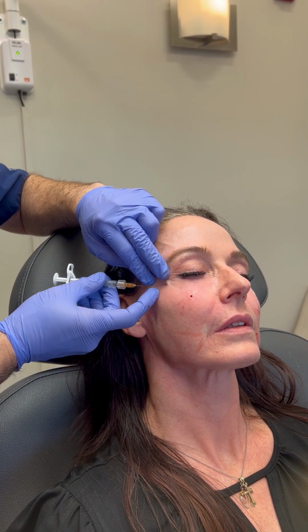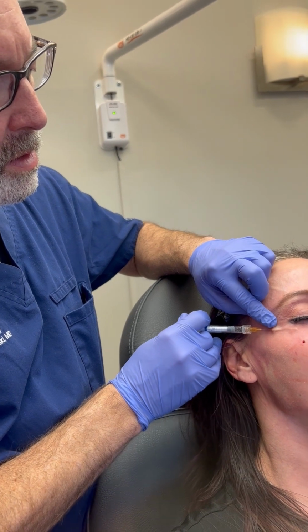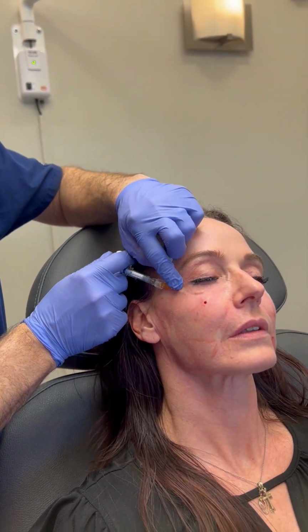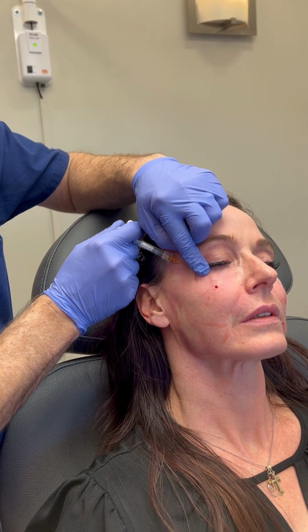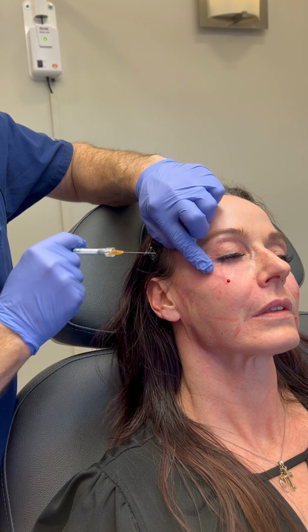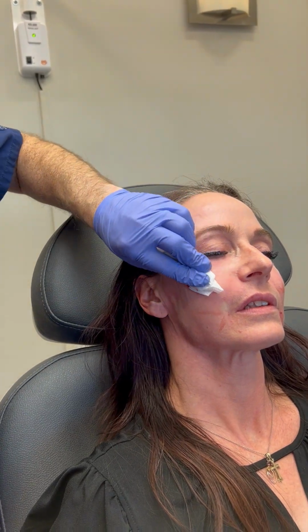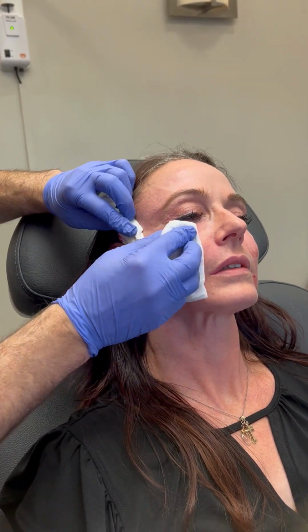Always do under eye with cannula. And it will smooth out by itself, so there's not much of a concern of any lumps or bumps right now. We can press it with our finger. Good.